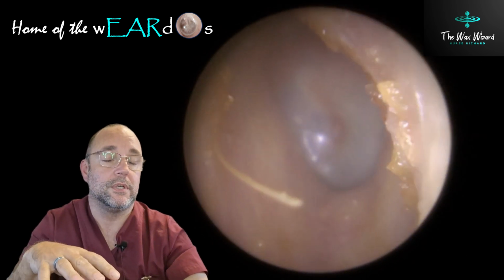But you do also hold the head in the brace position. So with both implements, you've got your other hand, you've got parts of your hand and your fingers supporting the head. So if they did move towards you or cough violently, the camera and the suction tube would still move with you, so there's less chance of doing any harm, so you always have to brace the head when you're doing it.